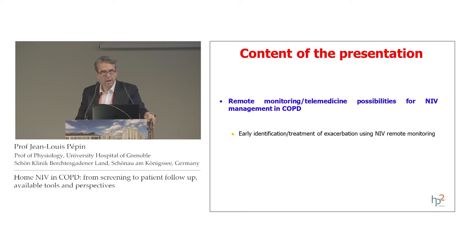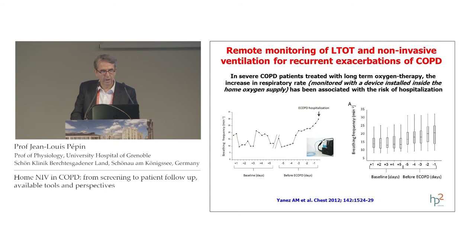The second topic is remote monitoring and its interest to identify and to treat exacerbation in non-invasive ventilation. And there are some previous studies in the field.